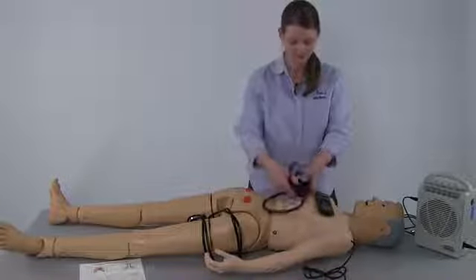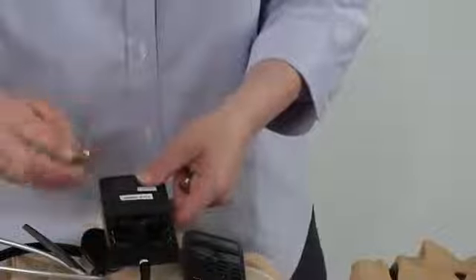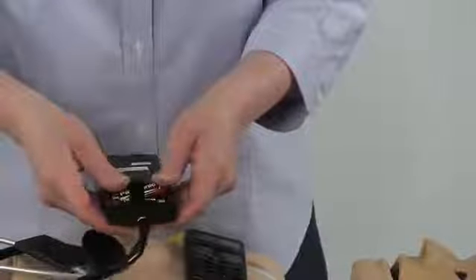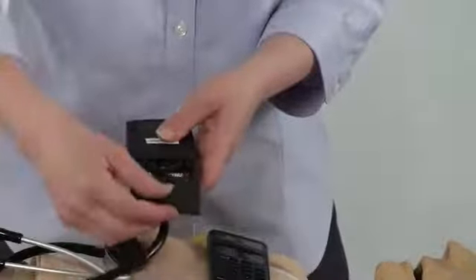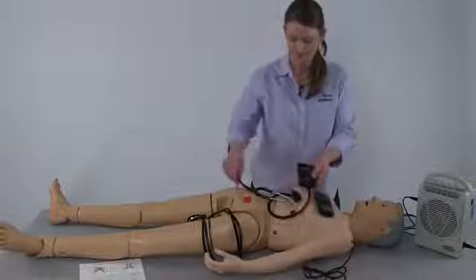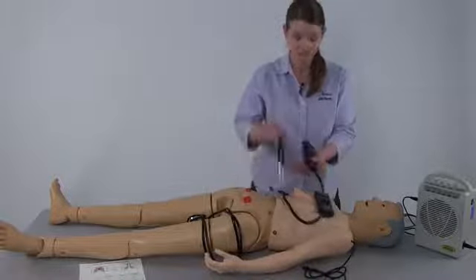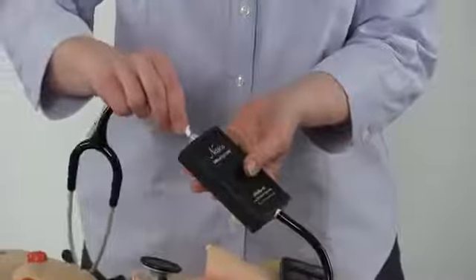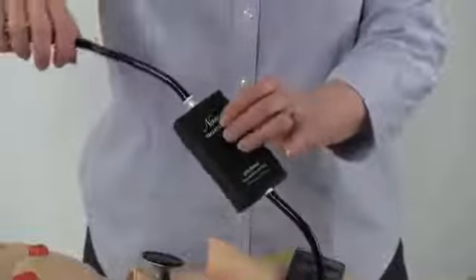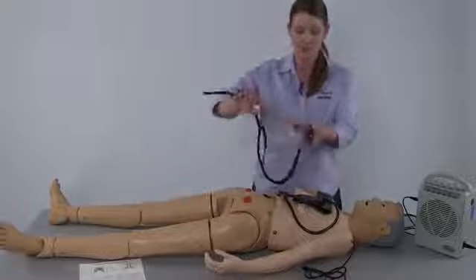Next, install the batteries in the smart scope. Remove the cover and install the two AA batteries included with the simulator according to the diagram in the battery compartment. Ensuring the batteries are firmly seated is important for both the smart scope and the remote. If using ear pieces, attach them by twisting the ear piece onto the top of the smart scope. Also included are teaching ear pieces that attach to the smart scope in the same way.